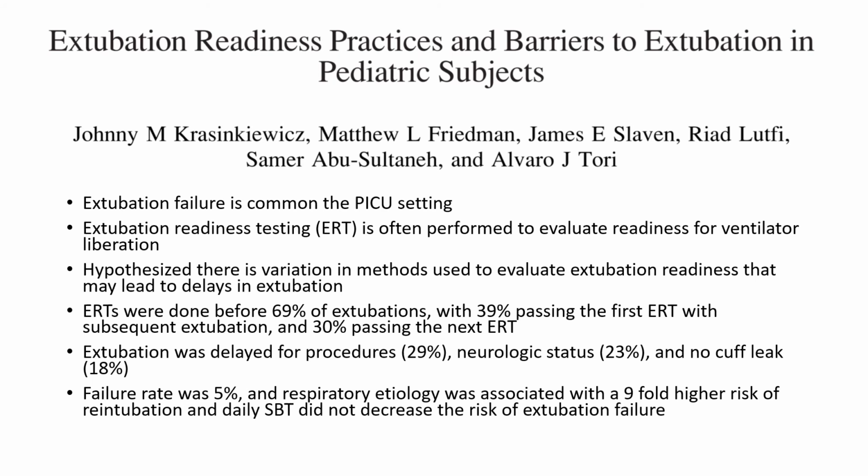So there's a relationship there, but it's not a super strong relationship between end expiratory lung volume and overall lung compliance. Our next paper is Extubation Readiness Practice and Barriers to Extubation in Pediatric Subjects from Johnny K. from the University of Indiana. What we know is extubation failure is common in the PICU setting. We do ERTs to determine if they're ready to come off the ventilator. This group hypothesized that there was a variation in the methods used to evaluate extubation readiness in their center, and they also wanted to identify any barriers to extubation in patients that had passed an ERT.